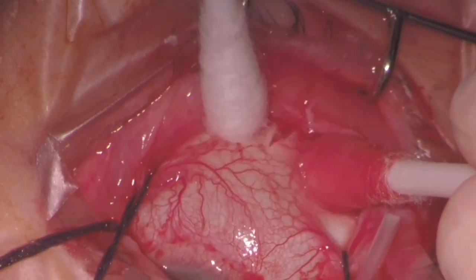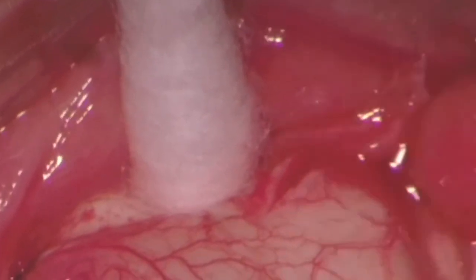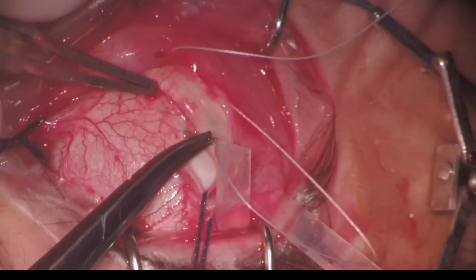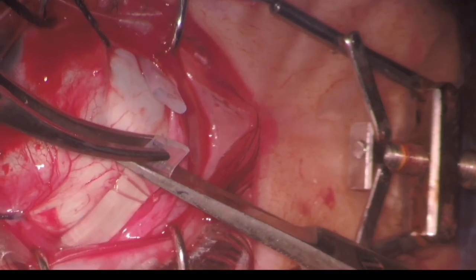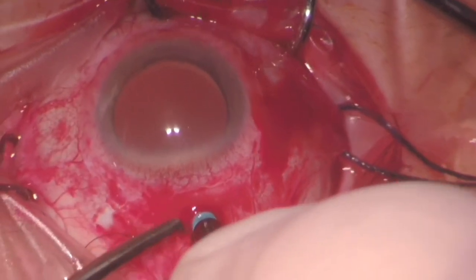Note that when depressing the site with a cotton swab, a small local bleeding occurs. At this moment in the surgery, this bleeding did not draw attention and the surgeon continues the step, suturing the buckle in each quadrant to perform the desired indentation. The sclerotomy suture was removed and the chandelier was replaced to assess the effectiveness of drainage and peripheral indentation of the buckle. However, it was observed the presence of a subretinal hemorrhage related to the drainage of the subretinal fluid.